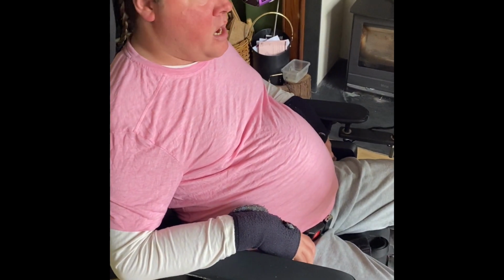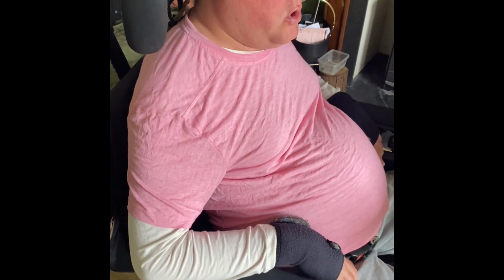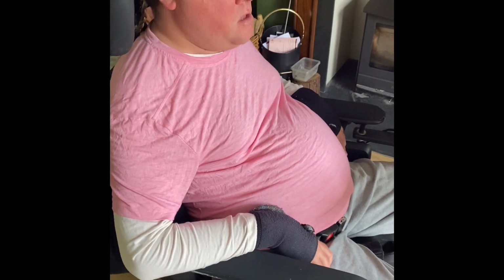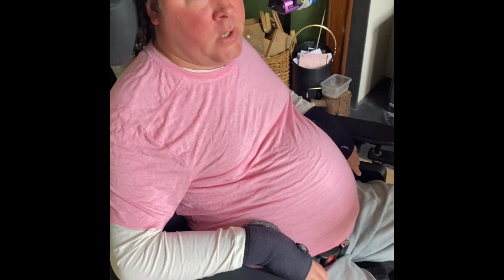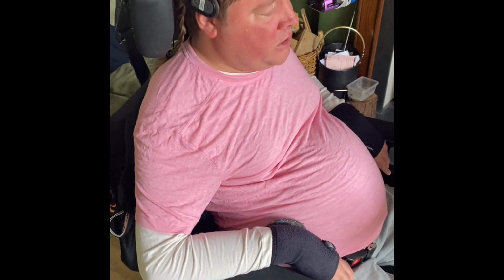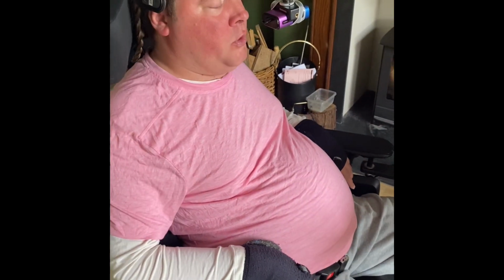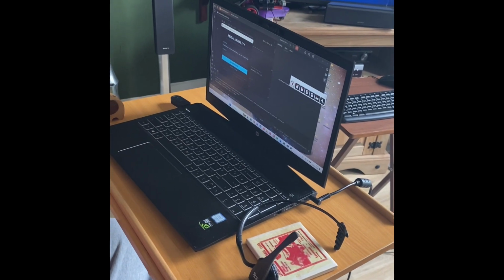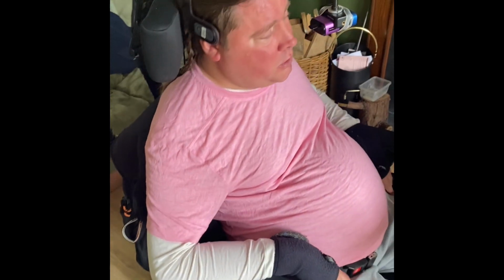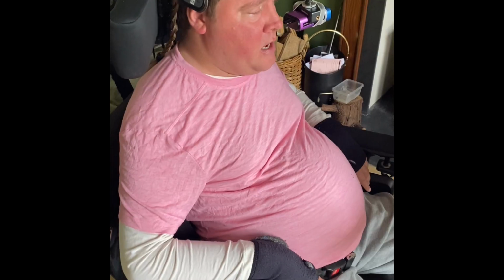As you can see, I have a different headset, which is an infrared QUHA style mouse controller for my laptop. So if I plug a USB into my laptop and wear the headset, I can control a mouse, so I can click anywhere and interface with my computer using head movements. The second mode of input will be voice input, so I'll show you how that works.